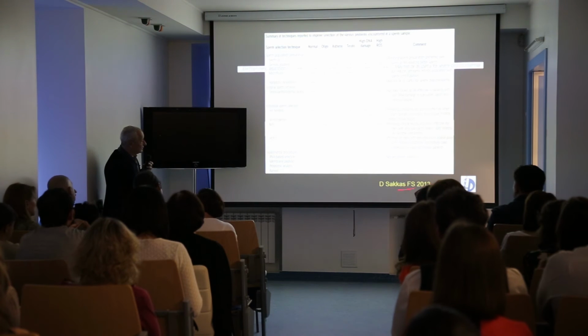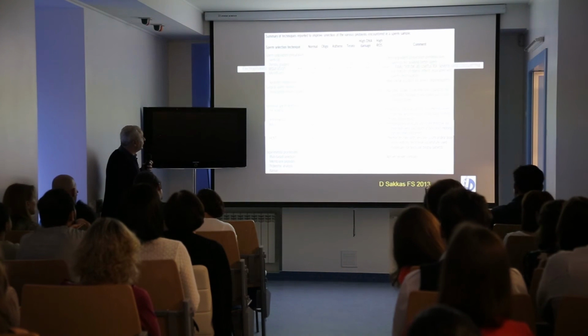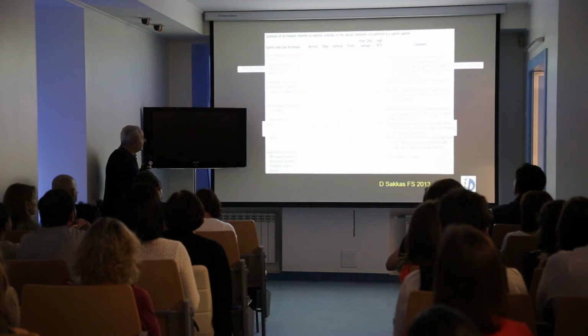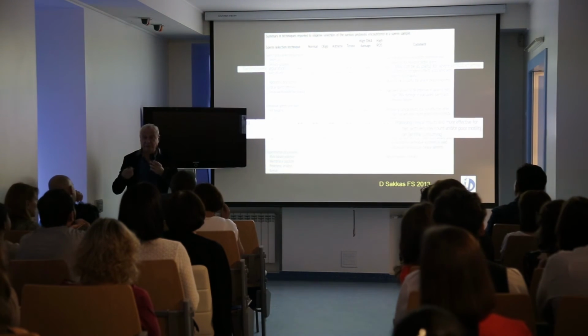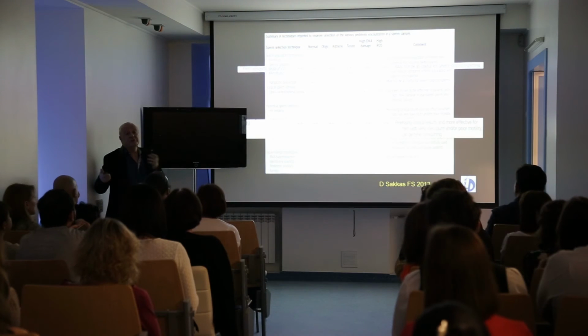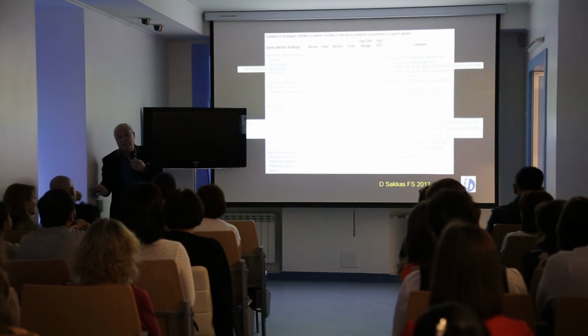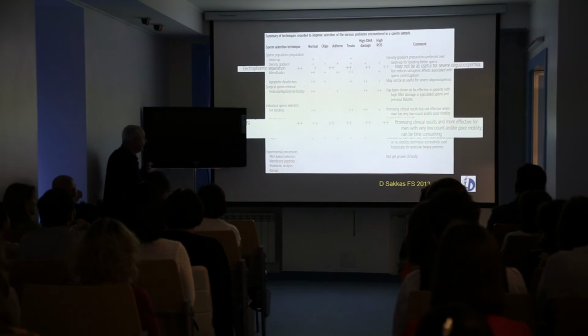This is Sakkas, who is working a lot on sperm. He said that the best system to separate sperm is electrophoretic separation, but also IMSI. And he said it's time consuming. It's time consuming if you are looking at different parameters, but it's not time consuming if you are looking just at the three and thinking of discarding the worst; you go quickly. Time consuming depends. If you are working to give the best for your couple, it's not time consuming, it's time for working.